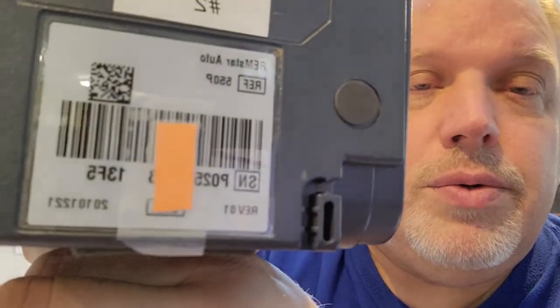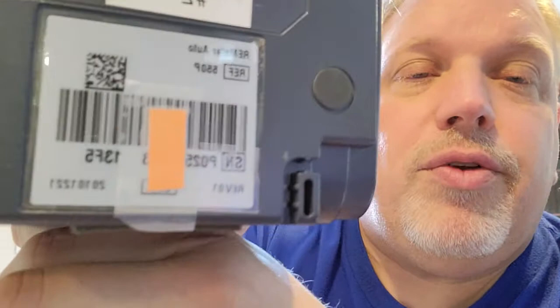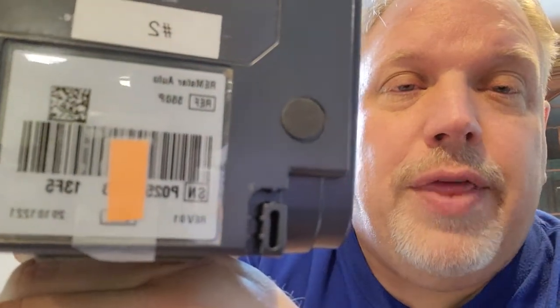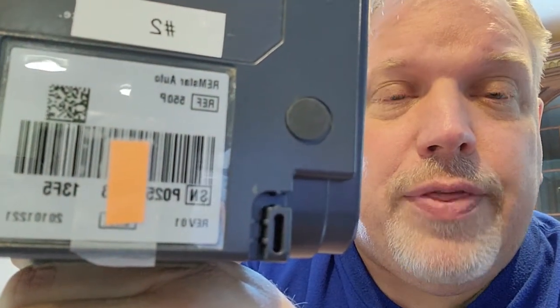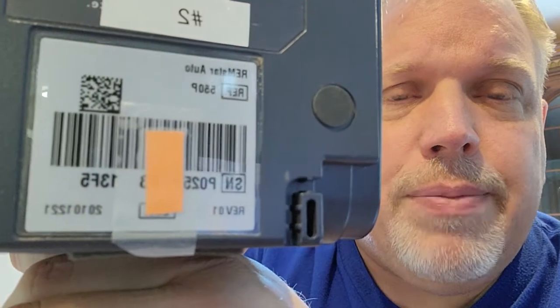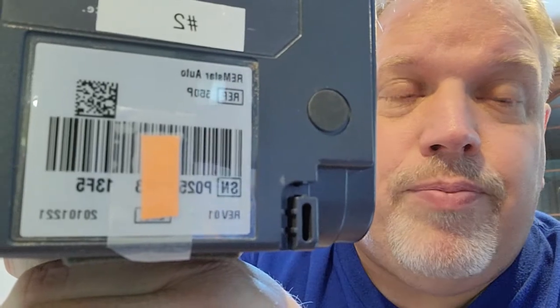The other thing is — I'm sorry about the glare — if you look at the serial number here, it starts with P025. Please make sure that's a zero as the second character, not the letter O. You can try it both ways, but more than likely it's going to be a zero, not the letter O. Same thing at the end: 13F5 — that last character is probably a zero, not the letter O.